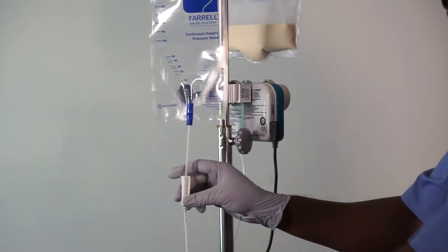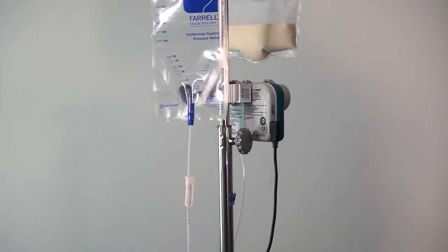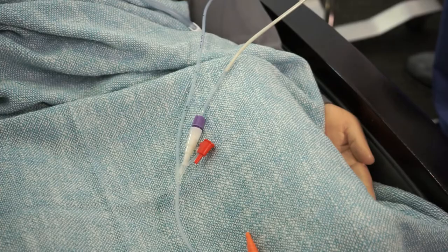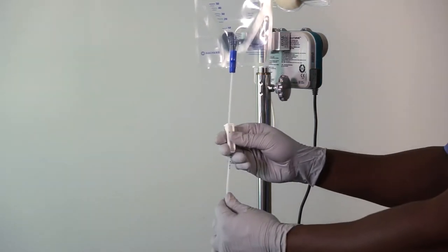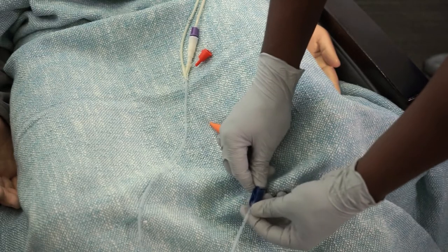Open the white roller clamp and prime the giving set. With the pump in operation, allow the feed to travel a short distance up the line towards the Farrell bag. Close the white roller clamp, open the blue clamp, and continue to prime the giving set.